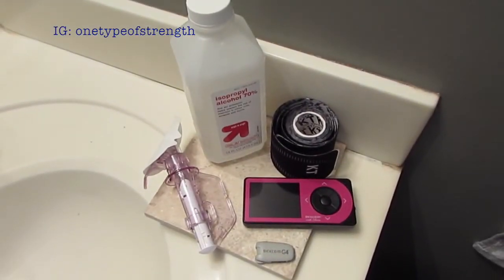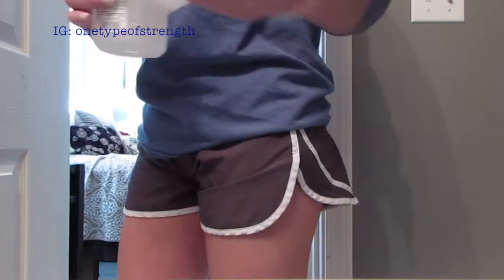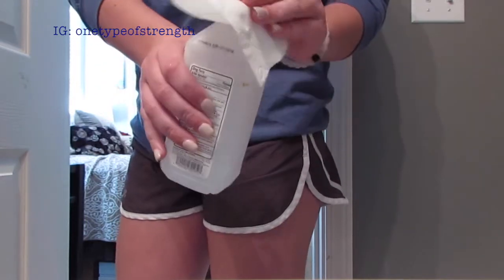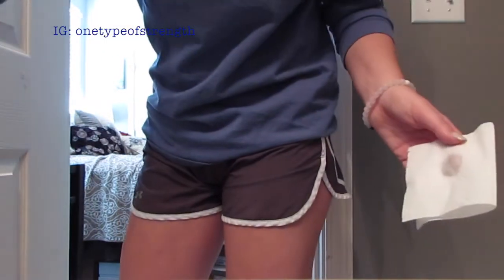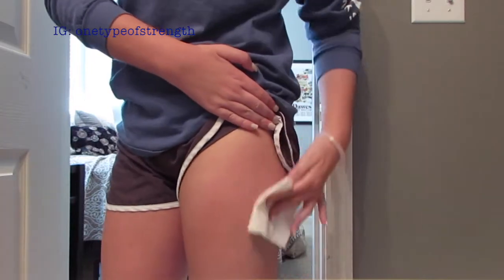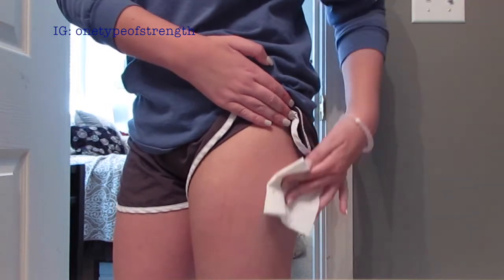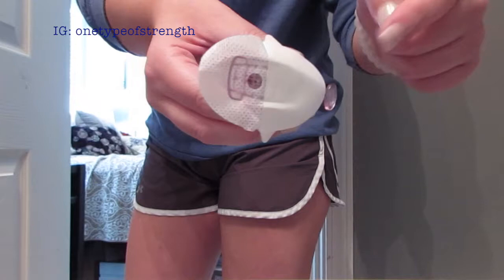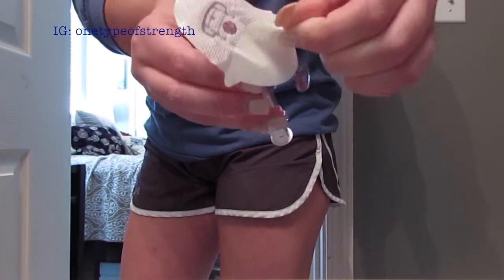If you'd like to see a more in-depth video of the insertion, I'll link that down below. The first step to changing the Dexcom sensor is to take rubbing alcohol and clean the area where I'm going to place the sensor, which is going to be on my upper thigh area.